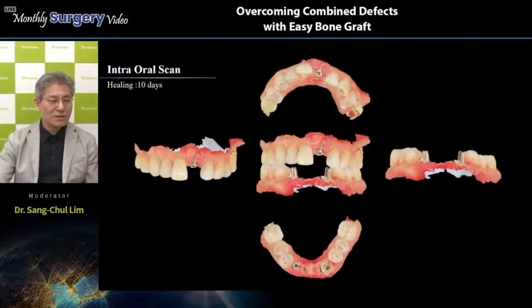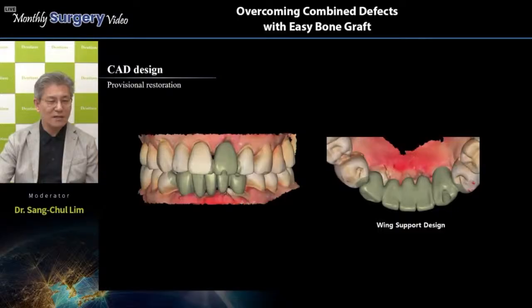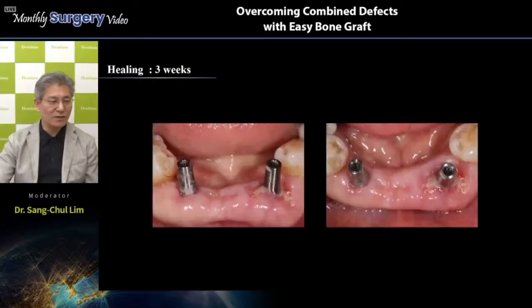Okay, after all of this surgical procedure, we go to another step, using the scanner to scan all of this intraoral situation to make temporaries. Intraoral scanning and the CAD design are shown here. Dr. Chung preferred to use a wing support design for the temporary prosthesis. On the right side, you can see the wing. This wing is attached to the neighboring teeth with resin bonding.